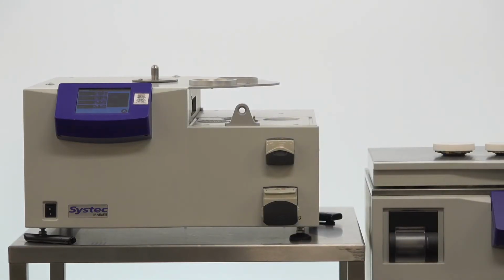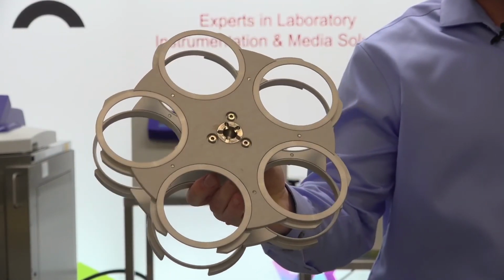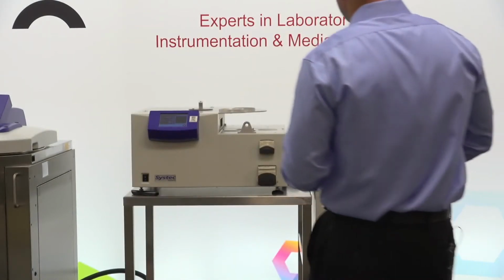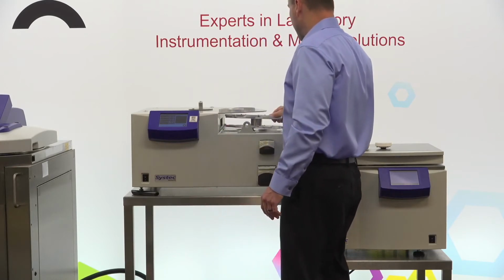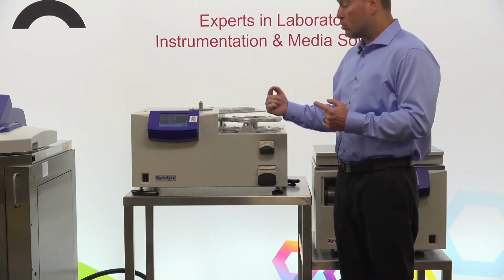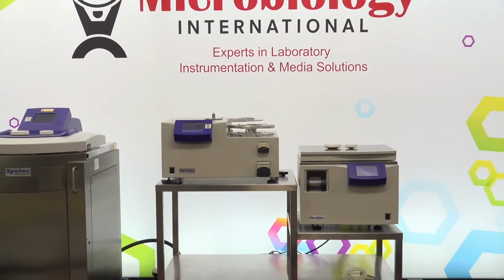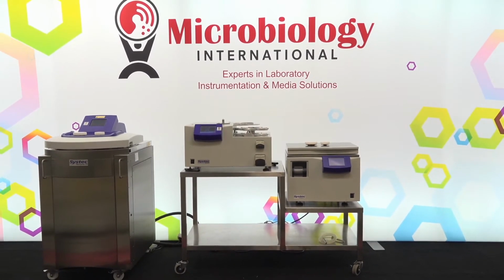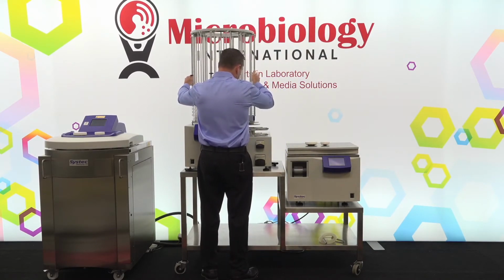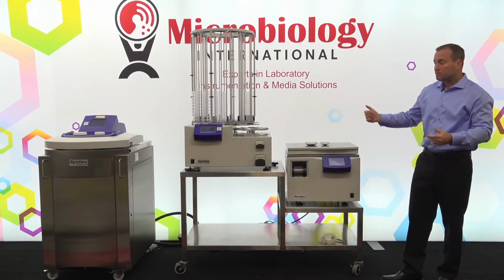The way that items fit inside of here, the revolver, what you'll see is there are little locking areas inside of that, and the unit will find its home once this is put into position. So we do not need to really specify exactly how this goes in. Once it sets down into position, when we start a cycle, it would go through and find its home position before we would start. Then we can just replace the carousel. And now we've cleaned the unit and we're ready to move forward, okay?